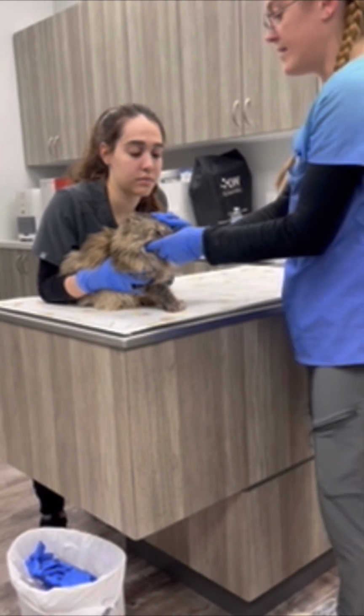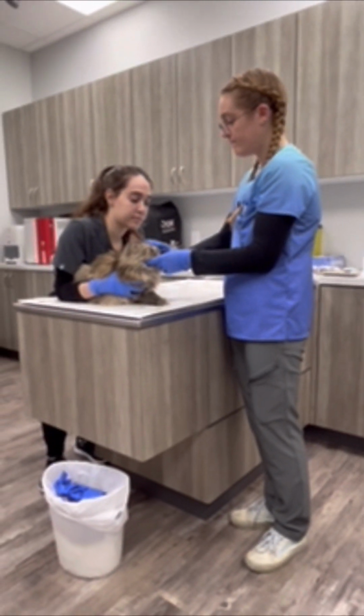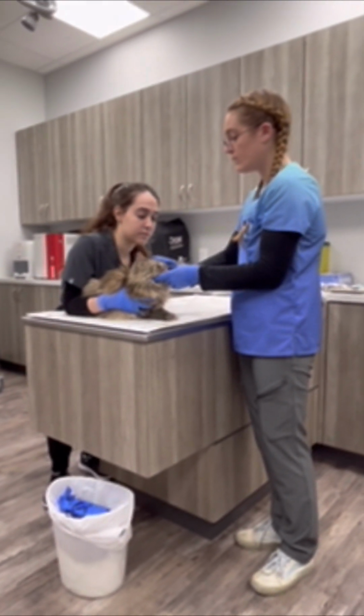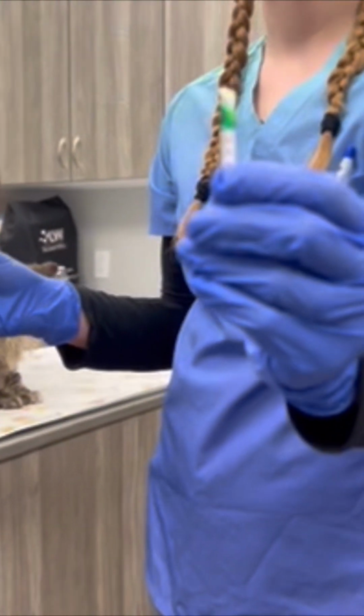And then waiting 1 minute for the test to complete. 1 minute has passed, and the reading is 15, which indicates normal tear production.